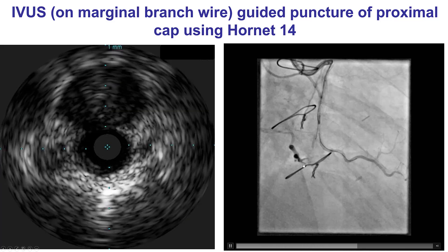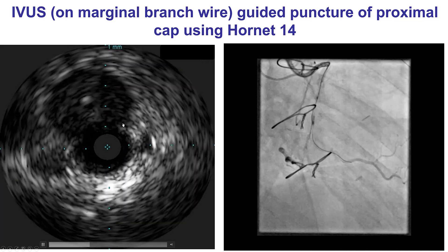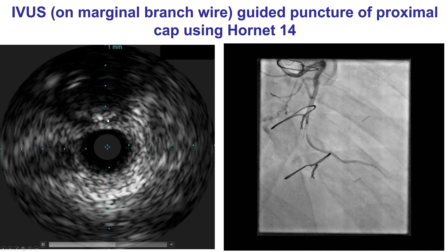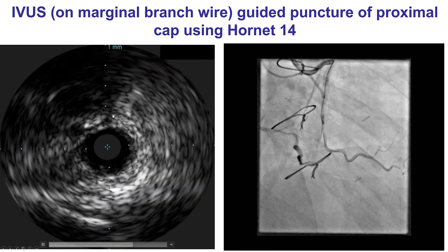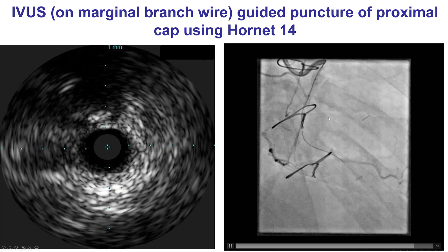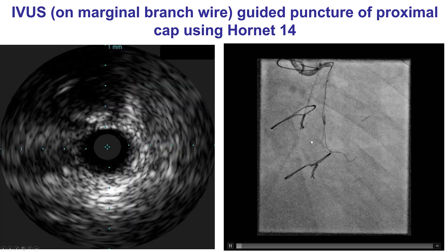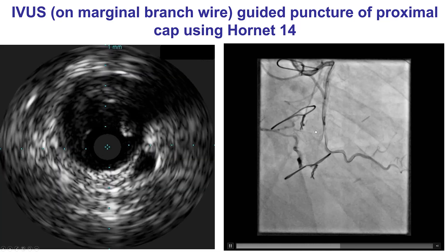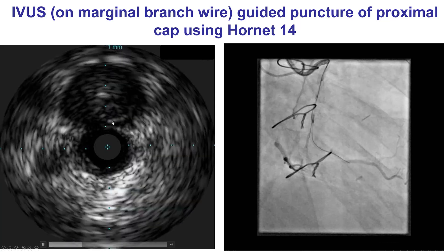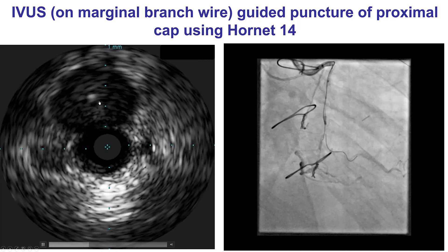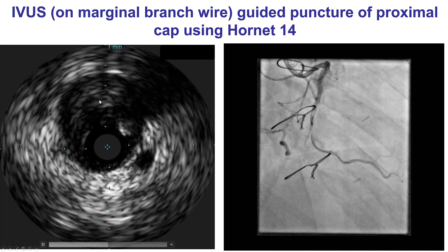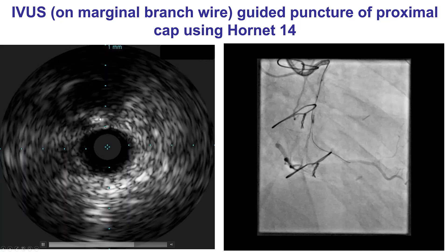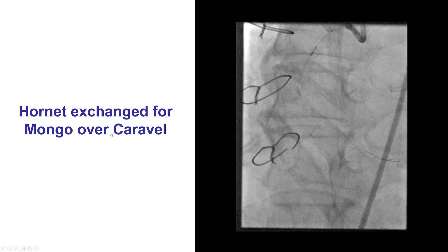Given the ambiguity of the proximal cap, we decided to do intravascular ultrasound, which nicely demonstrated the location of the proximal cap. We then did puncture of the proximal cap under intravascular ultrasound guidance using a Hornet 14 guide wire. As we can see on the IVUS, the wire seems to be entering into the intima, into the plaque of the chronic occlusion.